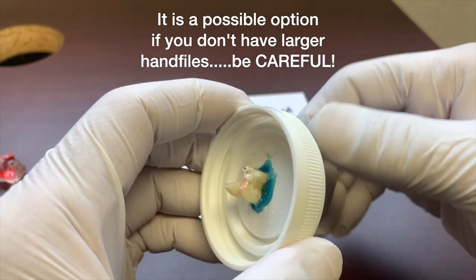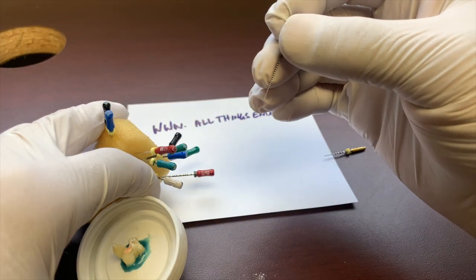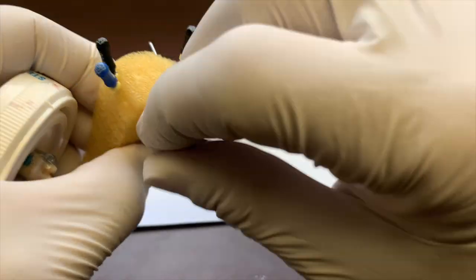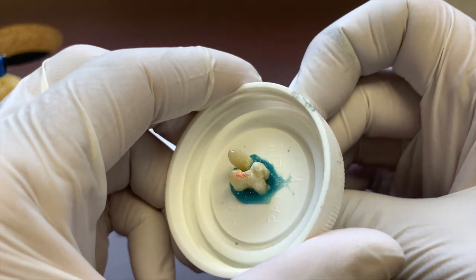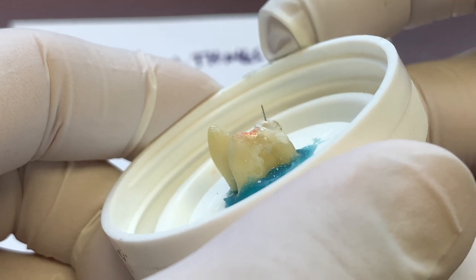At the same time as we're talking about this, if you're having a problem, I'm going to talk about really quick working length issues with your apex locator. If you're using a 10 or 15 file and you're trying to get your apex location with a 25, the problem is that this portion of the canal is so big. Look at this, a 25 that went out. Look how far I went out before I got any type of engagement.